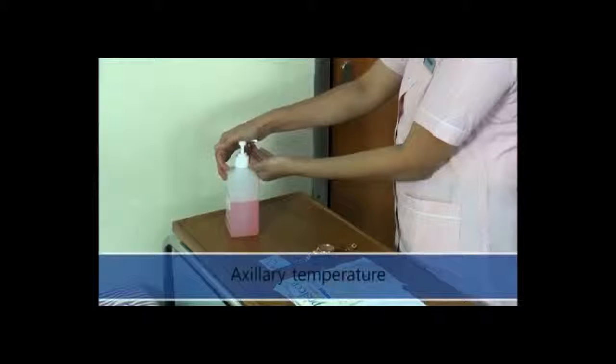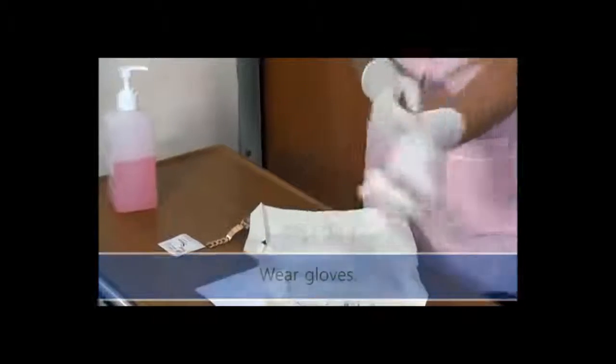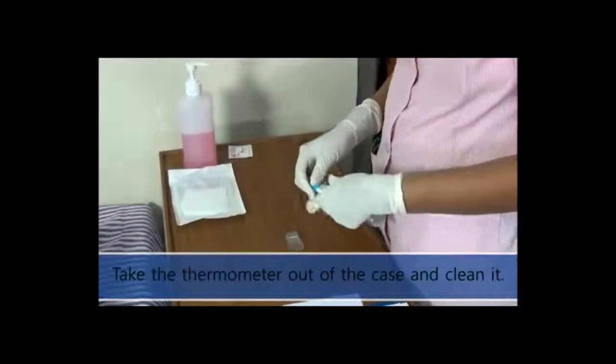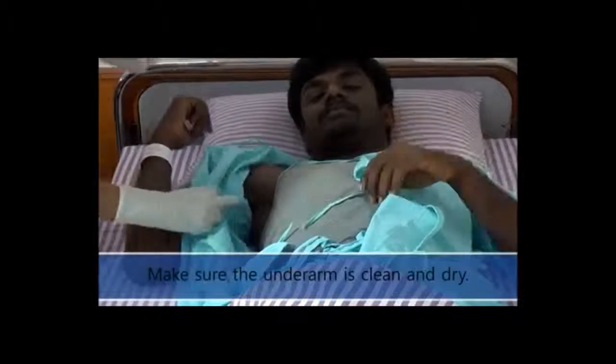Measuring axillary temperature. Wash your hands thoroughly with alcohol solution. Wear gloves. Take the thermometer out of the case and clean it. Make sure the underarm is clean and dry.